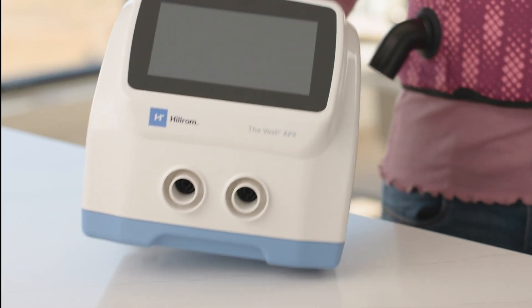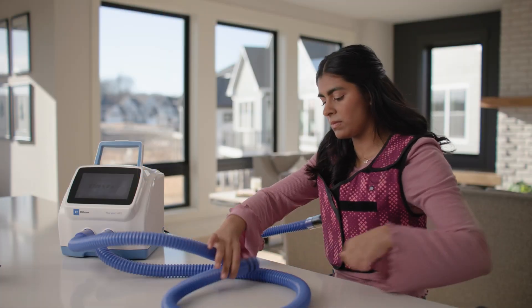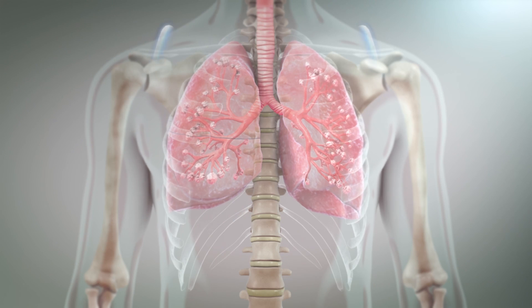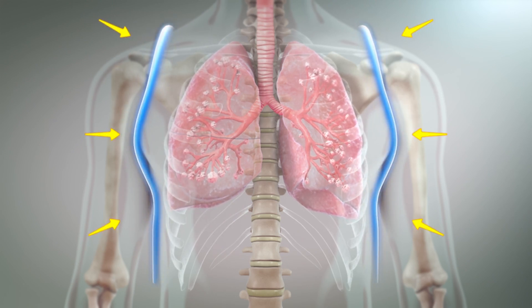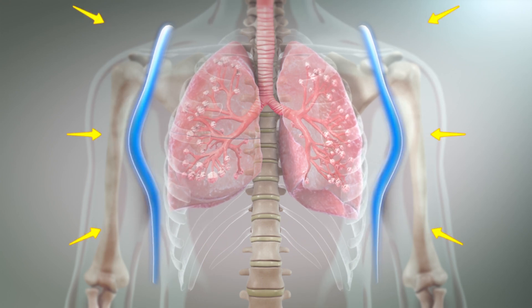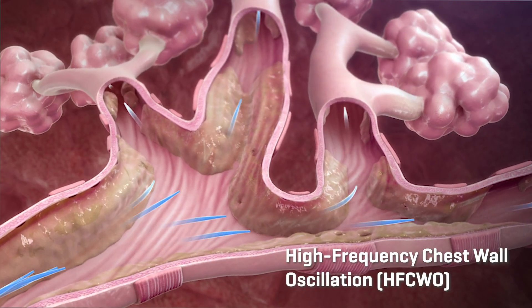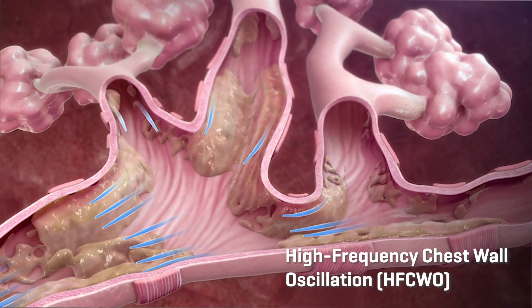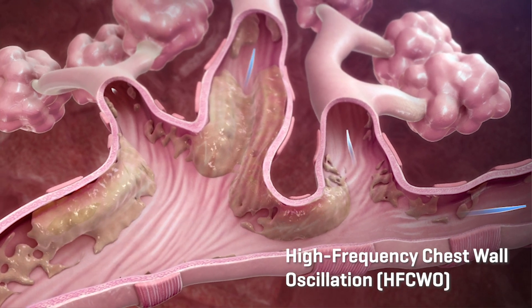The Vest APX system is made up of a control unit, a wearable vest garment, and two air hoses connecting them. Oscillating positive pressure air pulses are applied to the garment by the control unit. The resulting pressure pulses cause the garment to inflate and deflate against the chest of the patient, creating high frequency chest wall oscillation and mobilization of bronchial secretions. This form of airway clearance therapy is referred to as high frequency chest wall oscillation.